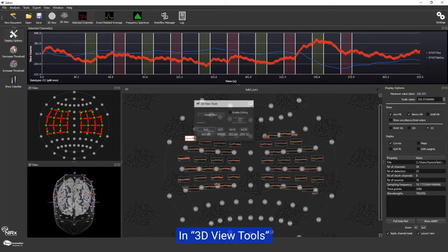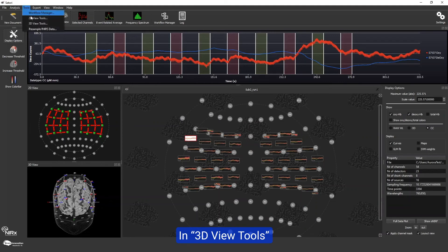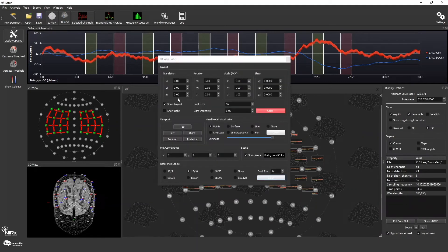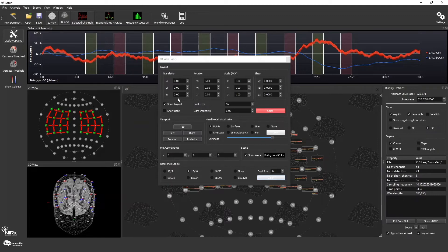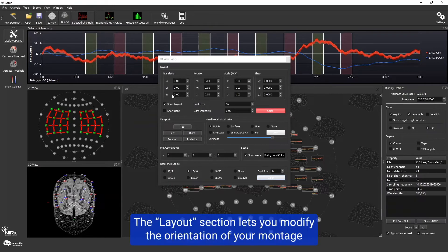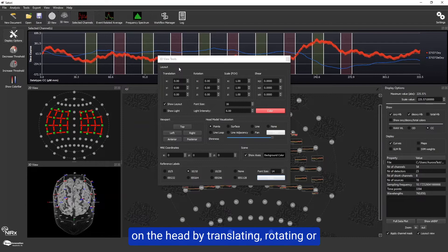In 3D view tools, you can modify many different parameters of the 3D view. The layout section lets you modify the orientation of your montage on the head by translating, rotating, or rescaling it relative to the head in 3D.